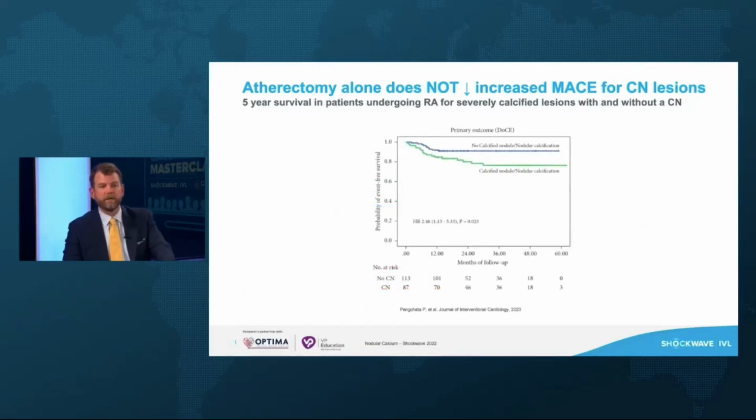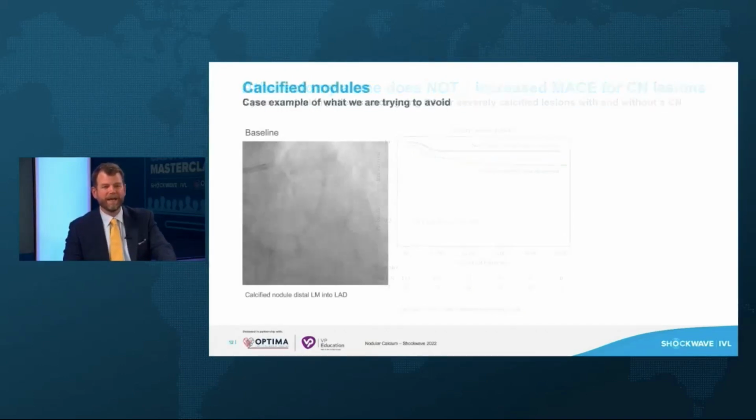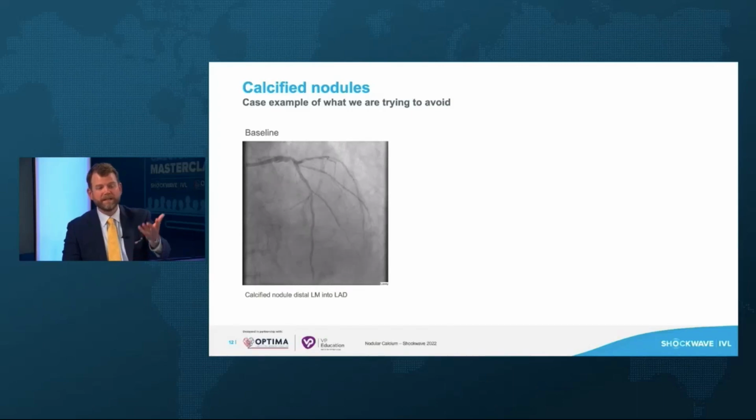Again, another study showing the same thing. Unfortunately, even when the old traditional calcium modification tools are used, we still just can't close that gap with nodules. And this is an example of really what we're trying to avoid, right? For a long time, this is what we had.